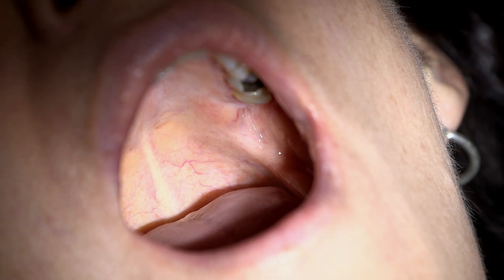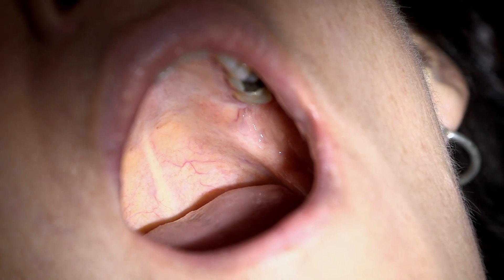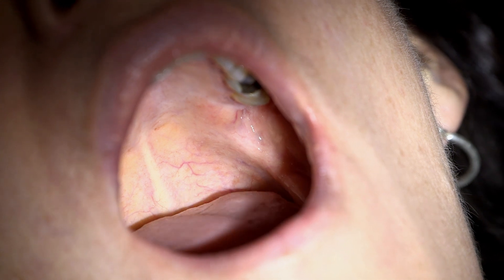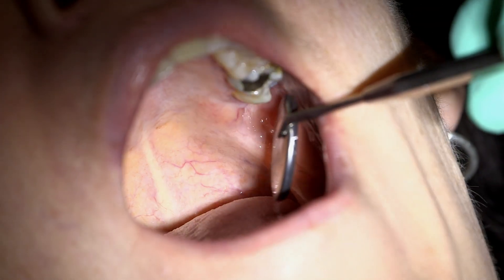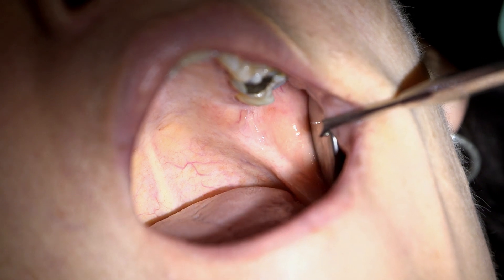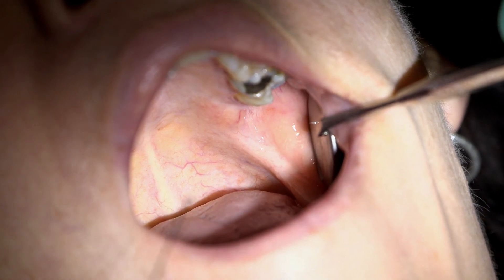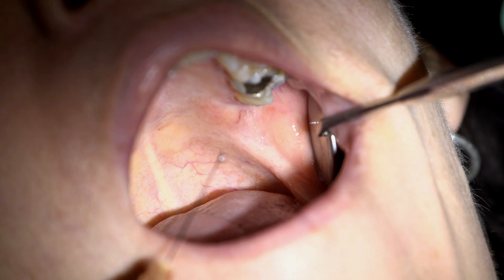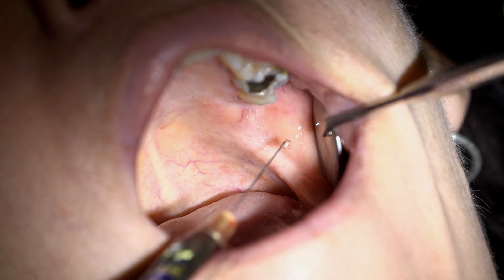A long needle will be required for the inferior alveolar nerve block injection. Use the mirror to retract the cheek, ensure the tissue is taut, and ensure the patient has opened wide. Place the barrel of the syringe over the contralateral premolars and prepare to insert the needle.